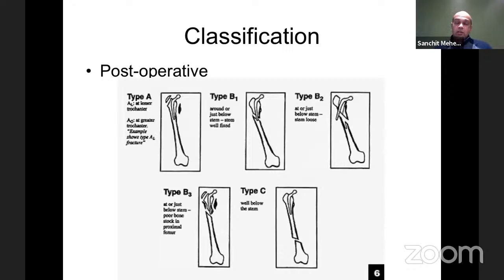All these classification systems were devised initially for uncemented stems and had then been extended to be used for cemented ones. And therefore, there is an issue with this: even if the fracture is just below the tip, but the cement is cracked, then it's a type B fracture rather than type C. And the B classification system is further subdivided into the stem being well fixed, that is the B1. B2 is where the stem is loose, but the bone stock is satisfactory. And then the B3 is where the implant is loose and the bone stock is quite poor. And we'll try and go through this with a couple of cases.